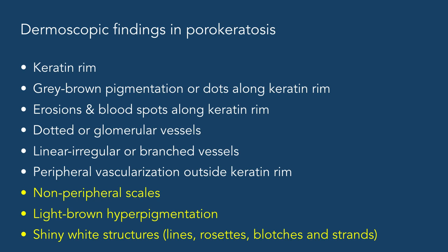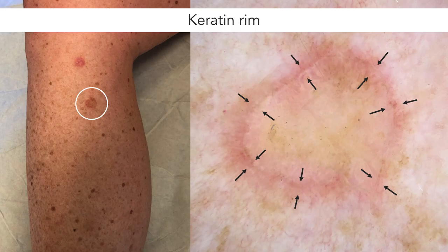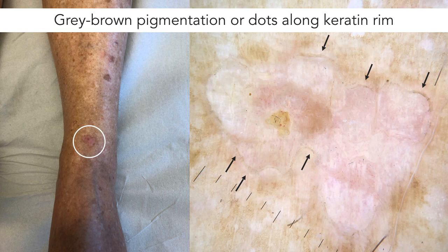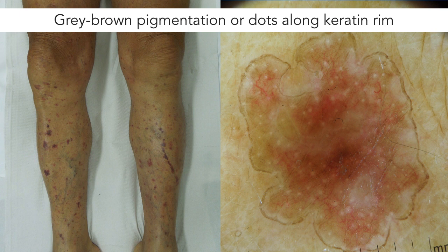Let's start by looking at dermoscopic features related to the keratin rim. Here is a typical case of porokeratosis in which dermoscopy reveals the full keratin rim highlighted in between the black arrows. In some cases, the keratin rim can display areas with grey-brown pigmentation or grey-brown dots. In this case, the whole keratin rim is heavily pigmented. This is also a nice case to demonstrate the atrophy of the central area, making the linear irregular or branched vessels more visible, as well as the follicular openings seen as white dots or small white circles.